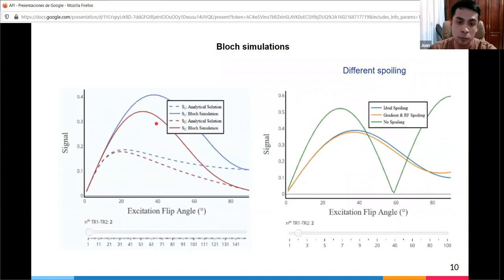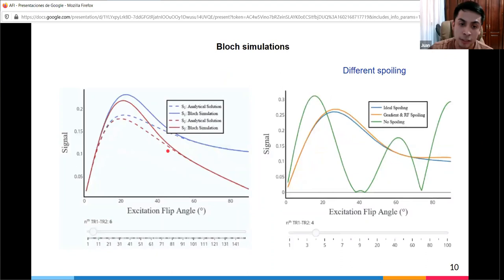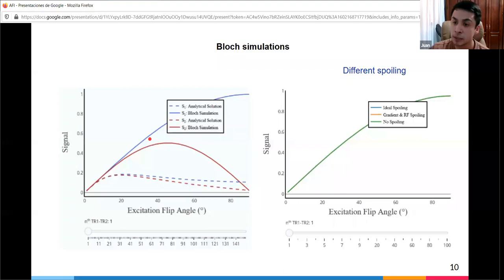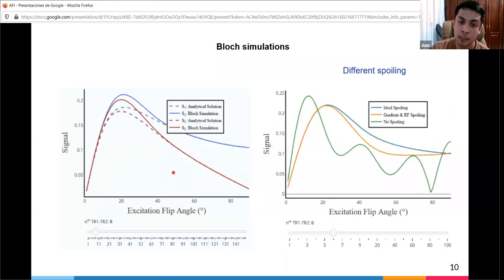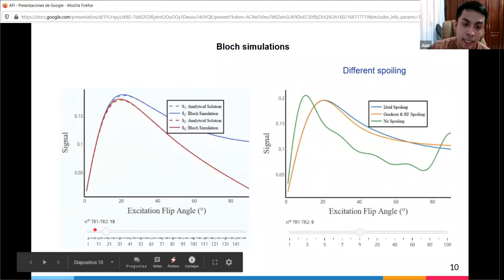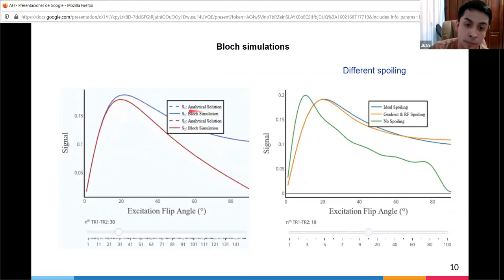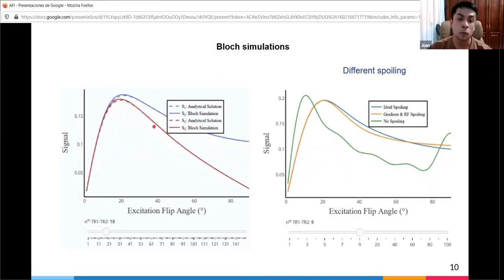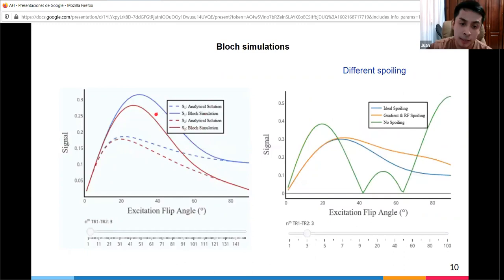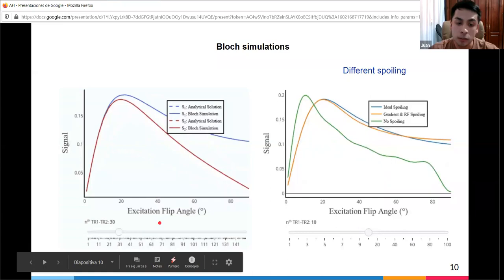The analytical equation assumes longitudinal magnetization has reached steady state after a certain number of repetition times, which is usually long, and that transverse magnetization is completely spoiled after each repetition time. Because fulfilling these conditions is a real challenge in practice, they added a module to run Bloch simulations to provide more reasonable estimates when the signal hasn't reached steady state. At a few repetition times, there's large deviation between the Bloch simulation (solid line) and analytical equation (dashed line). Blue is signal 1, red is signal 2. This depends on both repetition times and excitation flip angle.